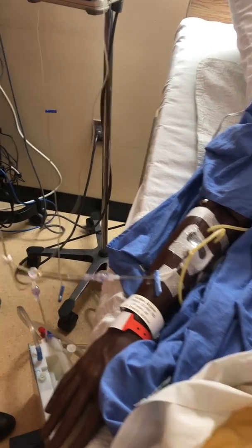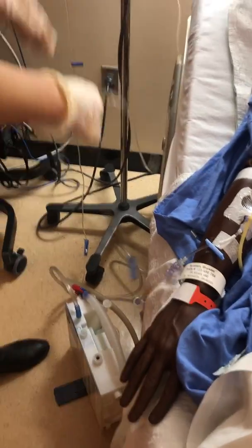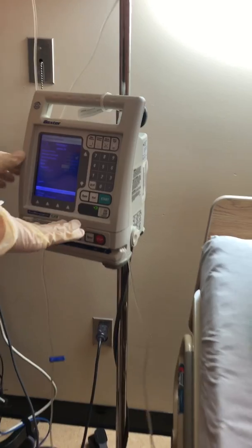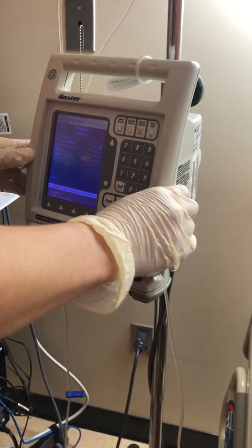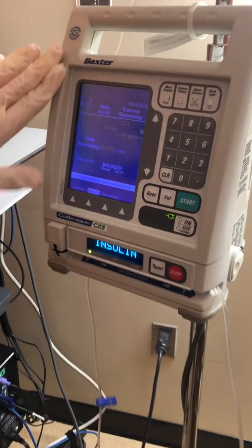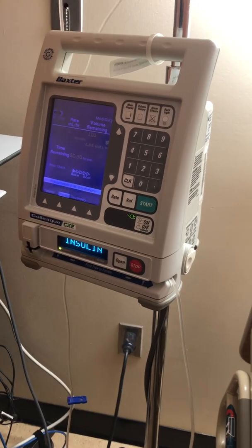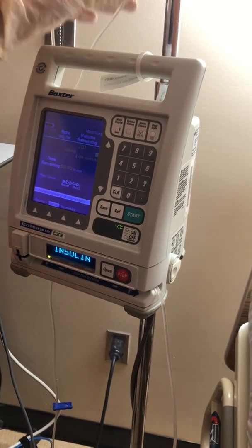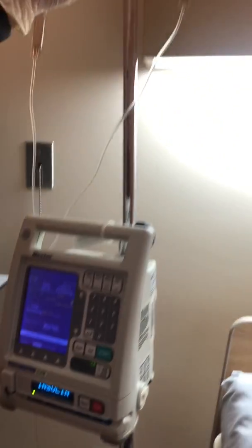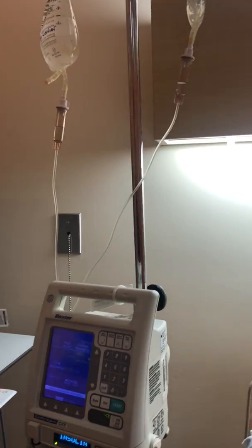Okay, so now I'm going to open this line here, make sure this is open, and then I've confirmed with 3 checks. So now I'm going to hit start. So I see that my insulin is running, my line is labeled, it's running at the correct rate, correct dose, and I'm going to wait for 3 drips just to confirm that it is running correctly. So I've seen my 3 drips.